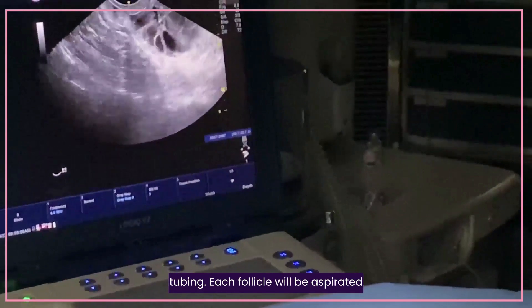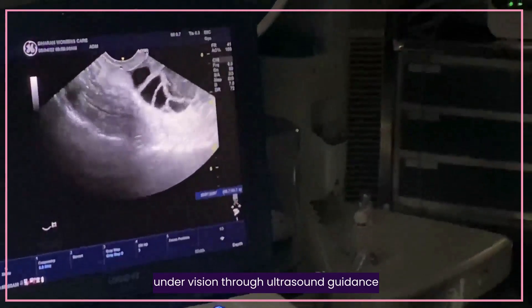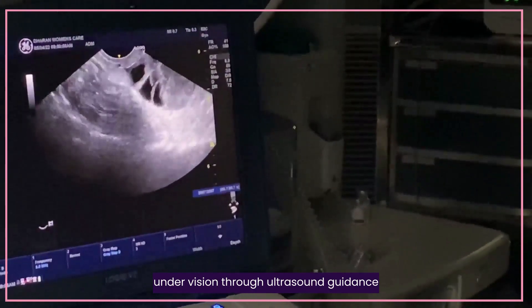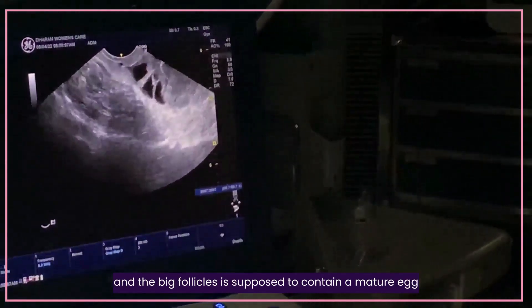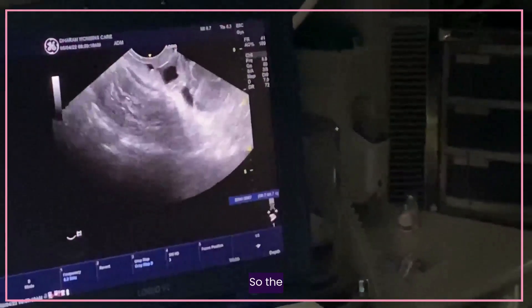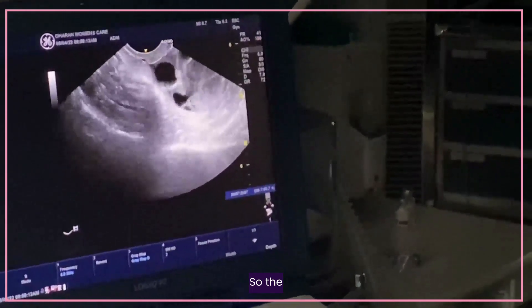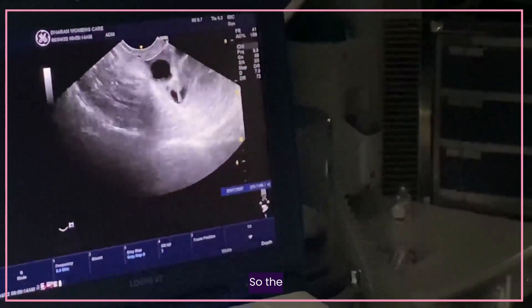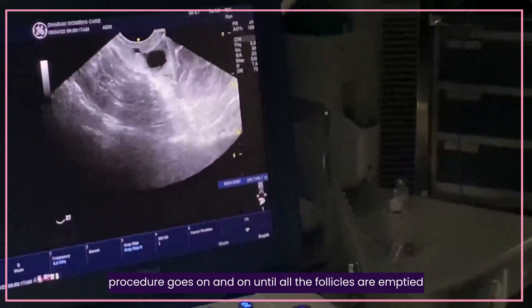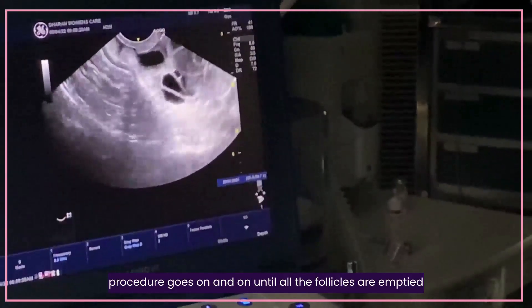Each follicle will be aspirated under vision through ultrasound guidance. The big follicles are supposed to contain a mature egg. The procedure goes on until all the follicles are emptied.